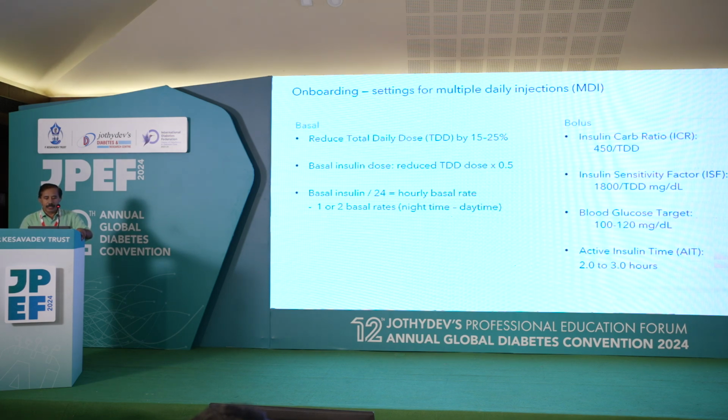We use the insulin carb ratio of 450 by total daily dose, insulin sensitivity factor 1800 by total daily dose, and we keep a blood sugar target of 100 to 120. That I have already told. We can keep 100, 110 or 120. And active insulin time, always start with maybe 2.5 or 3 and then bring it down slowly.